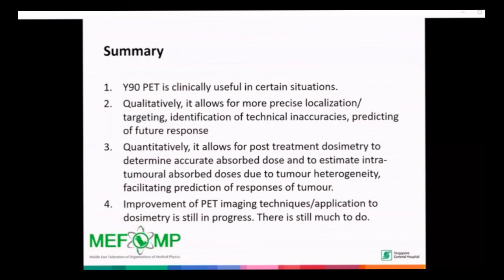Now, it also helps to improve the PET's imaging application to dosimetry, which is still work in progress, and there's still much to do.